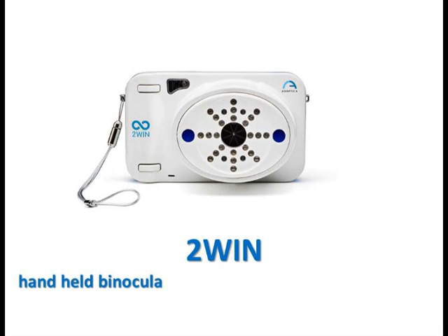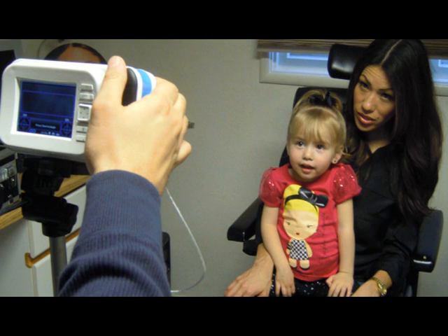The 2-WIN is a fully automated handheld binocular refractometer and vision analyzer. It measures refraction of both eyes at the same time, at a distance of 1 meter. The device offers significant benefits to the provider and the patient.